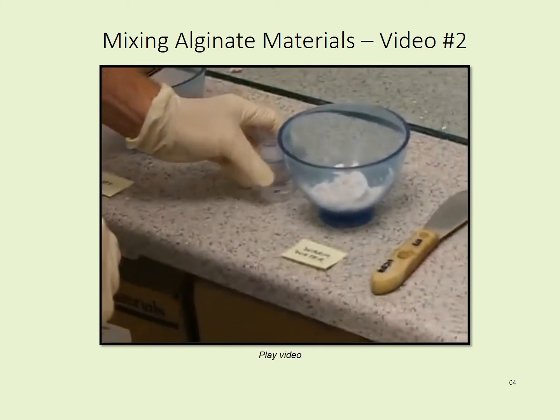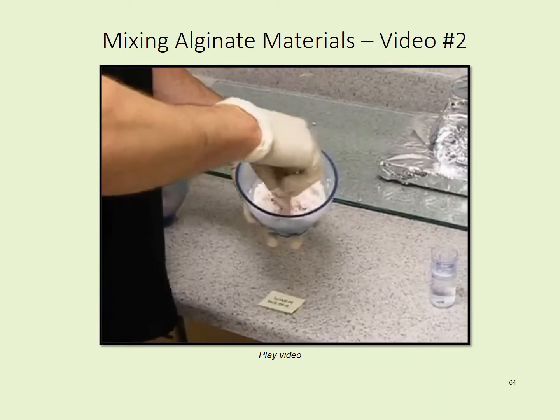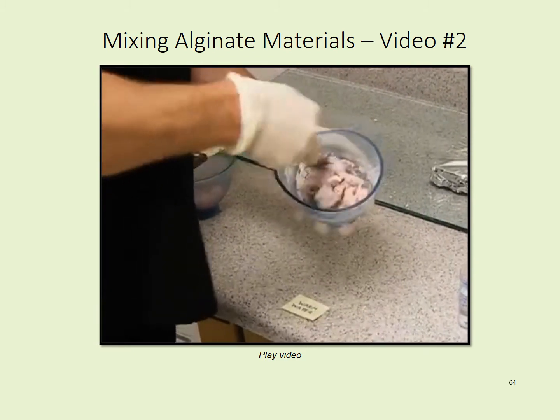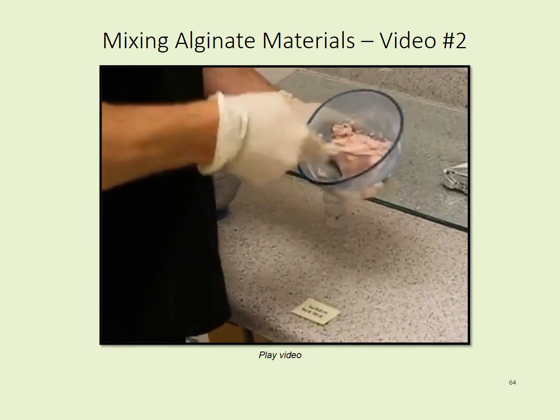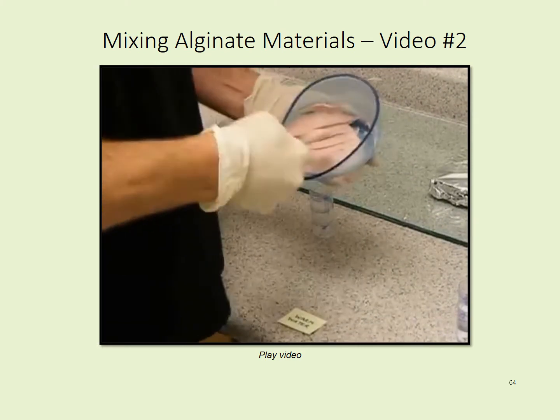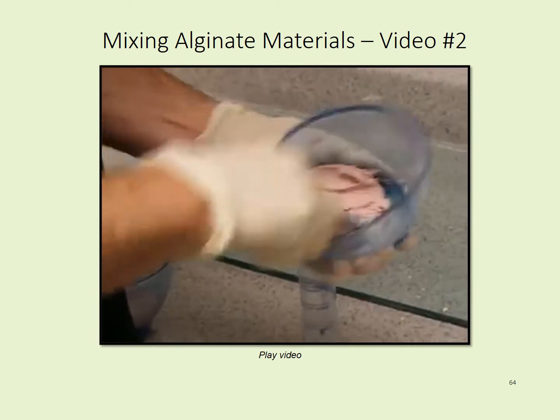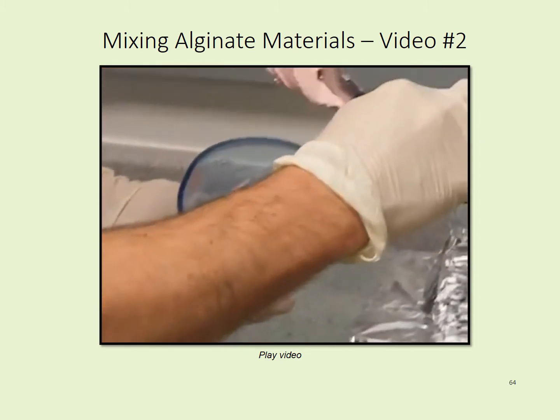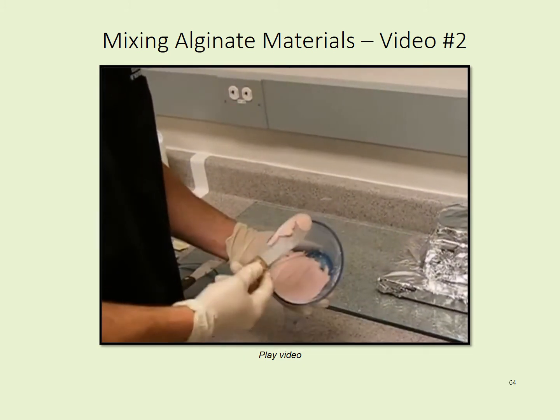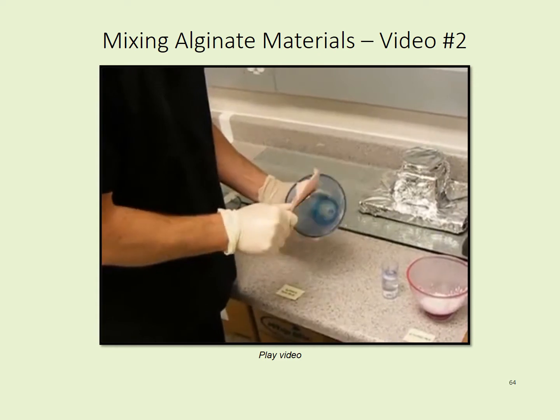A warm water mix, however, can be deceptive in that when you're mixing it, it will appear to mix just like a regular or properly measured alginate mix. It appears very smooth, very creamy, and can be scooped up onto your spatula very nicely without drooping off. The problem with a warm water mix is by about the time you get to where you're picking it up on your spatula to place it in the tray or to load it in the tray, it's already set.